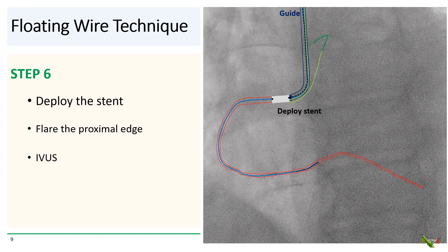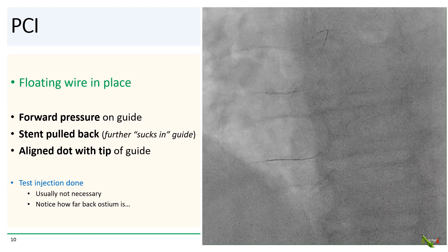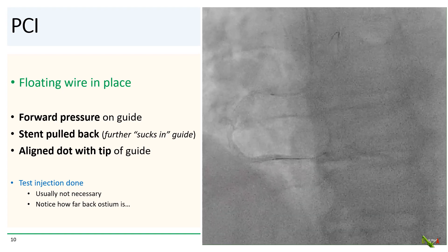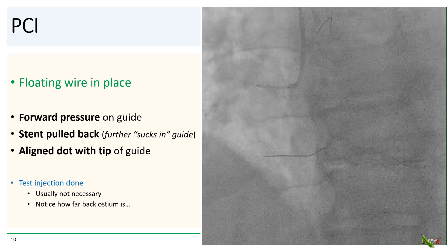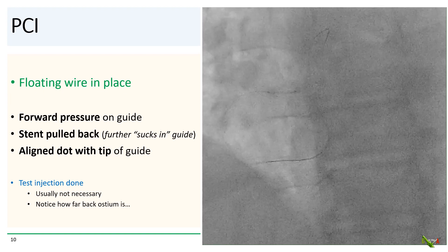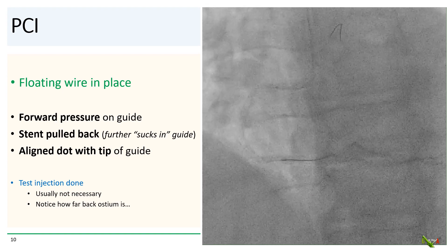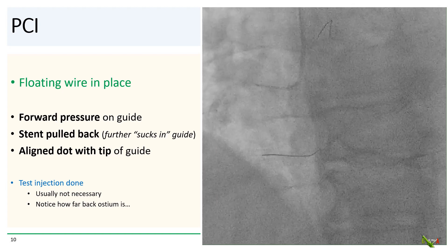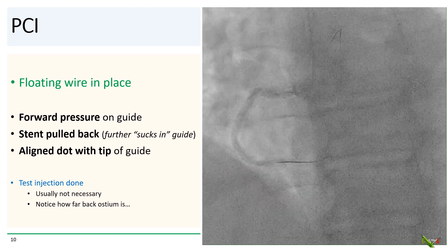IVUS is then often helpful to make sure that things look good. For our patient, we've got the BMW down the RCA and the Pro-Water in place as the floating wire, well out in the aorta. As we're applying forward pressure on the guide, the stent was pulled back, which further sucked in the guide, and we aligned the dot of the stent with the tip of the guide. We did a test injection here — which is usually not necessary — but you'll notice how far back the ostium of the RCA actually is. It's often a lot farther back than you would think.